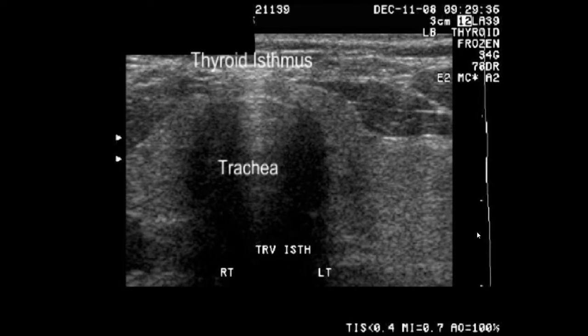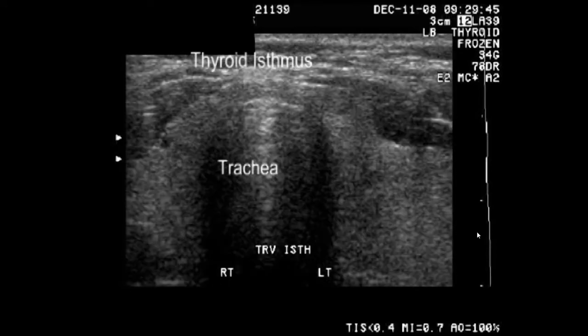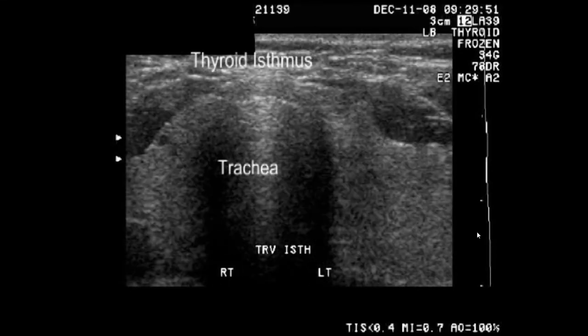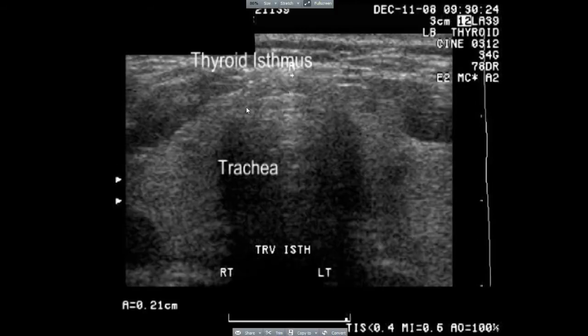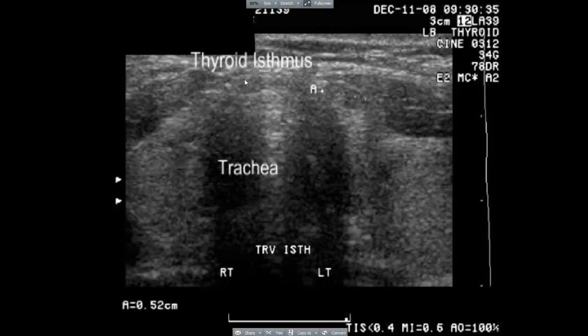This and the next few images are very impressive. They show the trachea very well in the small, thin thyroid isthmus which overlies the trachea.